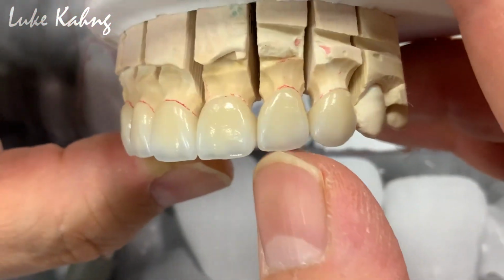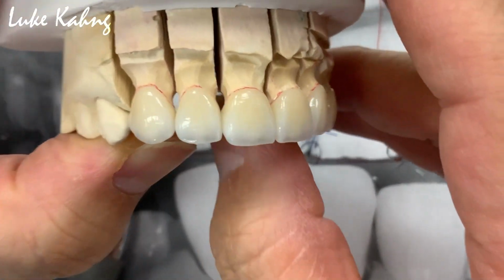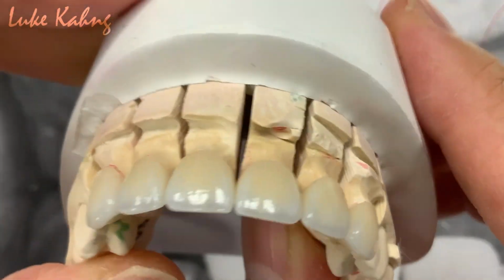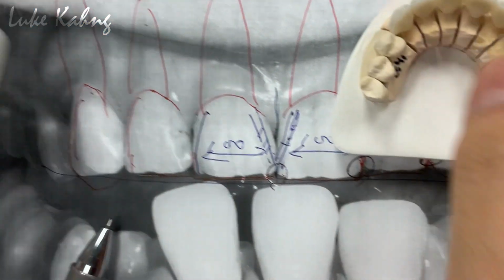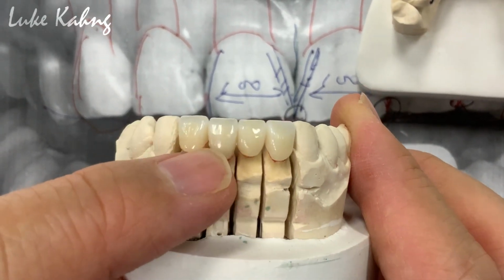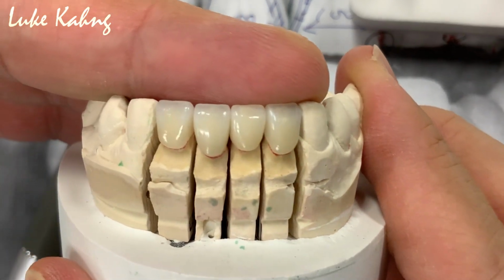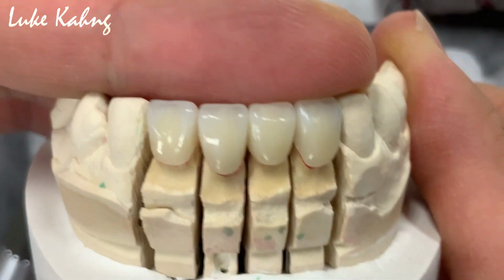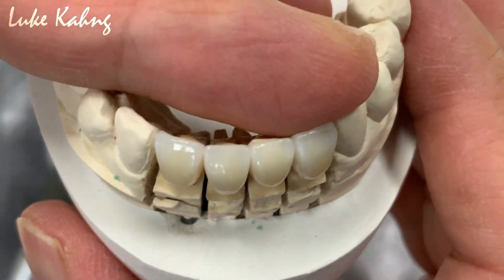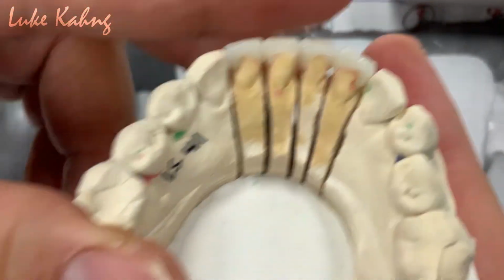So this restoration is the lower, a little bit more, same thing, other side. You see the side view. That was good. Then you can finish it. Now, we finished the lower as well. There is slightly a lack of room in this facial area. I wish I could get better room, but now it's 0.5 millimeter on the lower. You see the lower teeth, same thing, but less rasp compared to the upper. So this one is another aesthetic restoration we can get.